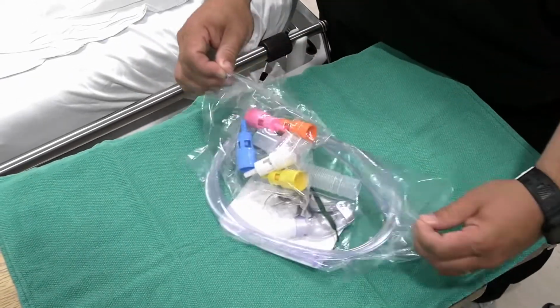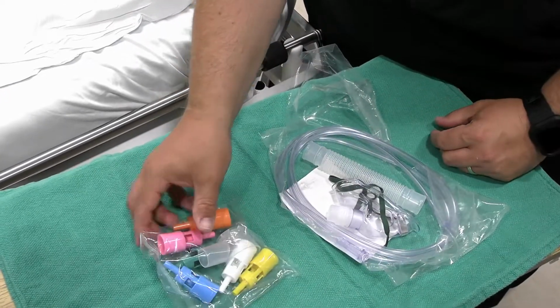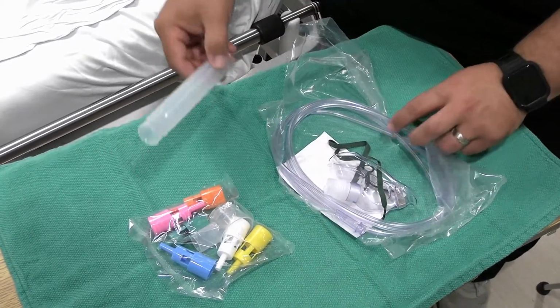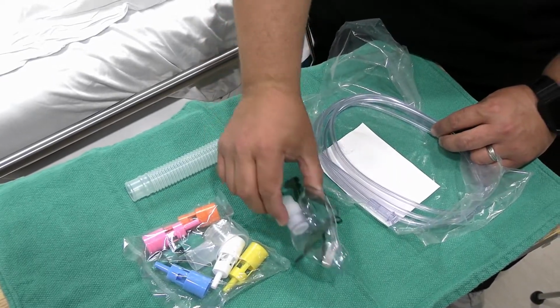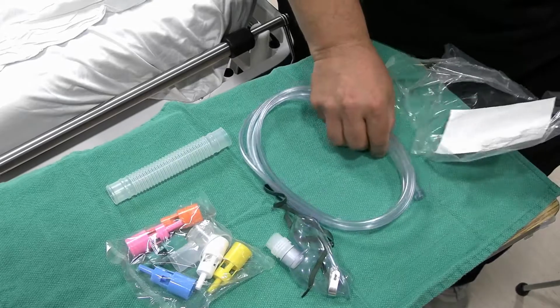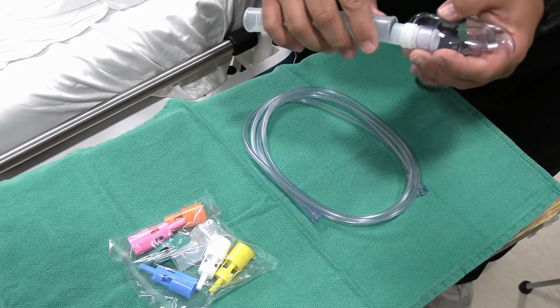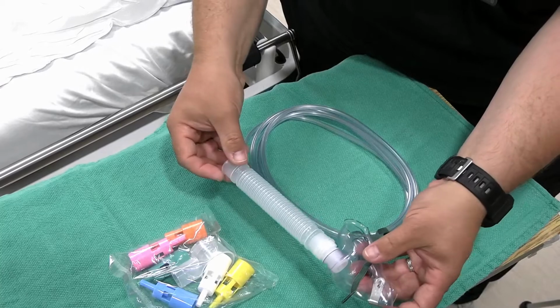So we open our Venturi mask. We have a baggie here of the different collars that will have your specific liter flows and FiO2 percentage. You have a 6-inch piece of corrugated tubing, a pediatric aerosol mask, and 7-foot oxygen tubing. In order to assemble this correctly, take your 6-inch corrugated tubing and attach it to your aerosol mask, just like that.